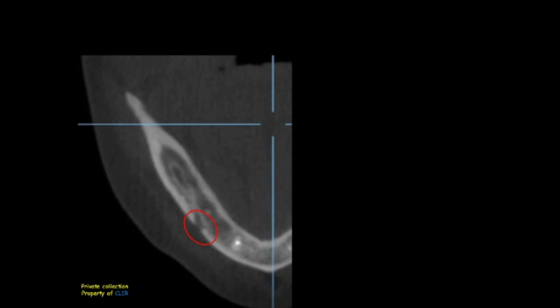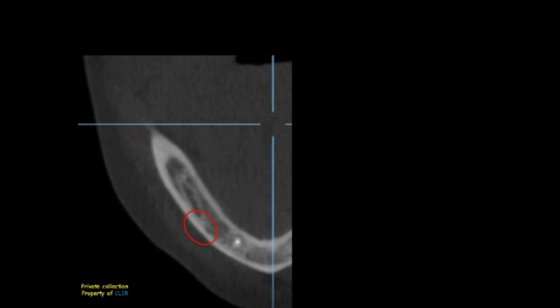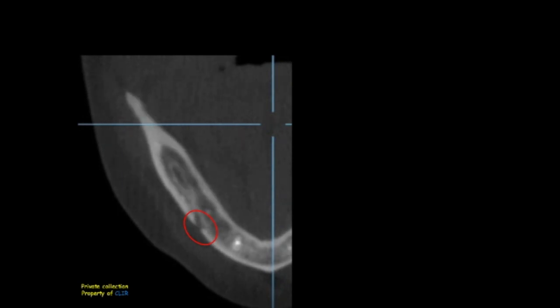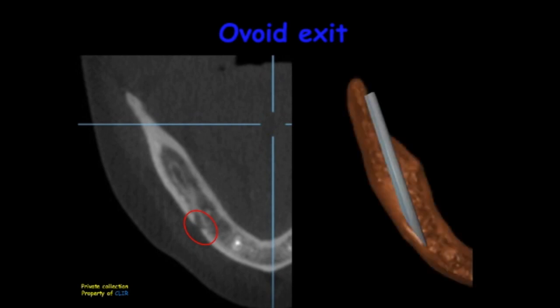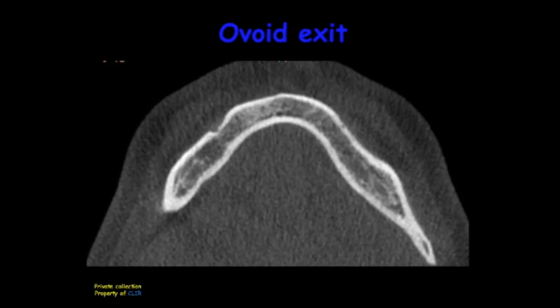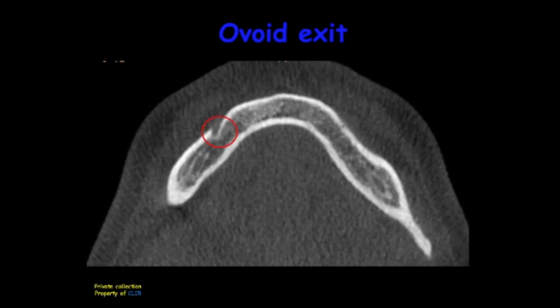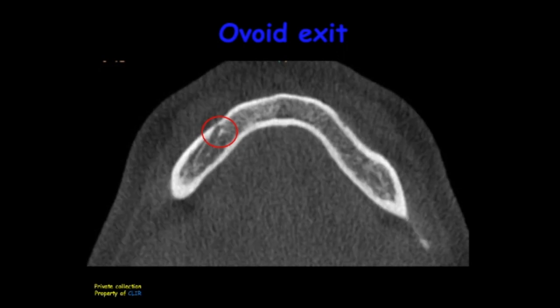If we look carefully at the axial section, we can see that the inferior alveolar canal approaches the buccal cortical of the mandible and exits directly through the mental foramen — this is why the foramen is ovoid. The path can be illustrated using a straw cut directly near the buccal cortical, and the section will be ovoid. Another case on axial cuts shows the same direct exit through an ovoid mental foramen.